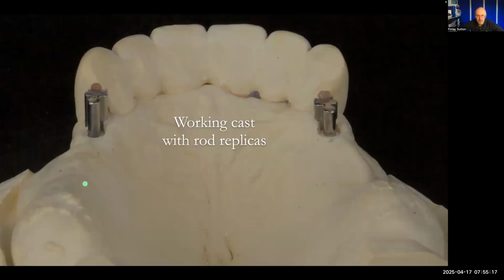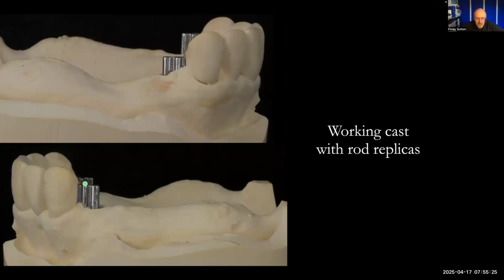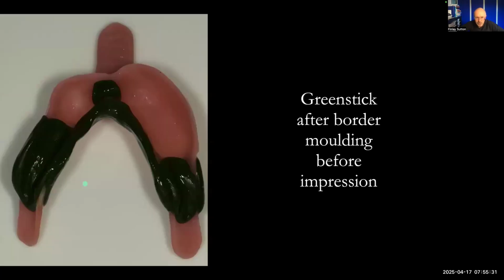So I've just trimmed that out so it's not going to affect the occlusion, so we can fit it into the existing bite. There. So look at that. Lovely rods on that working cast. Let's move on to the lower impression.